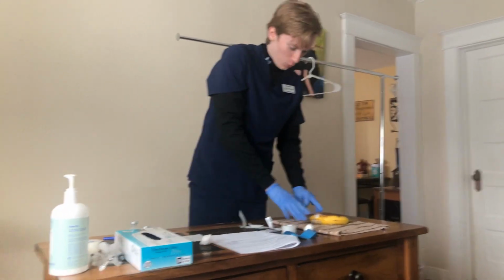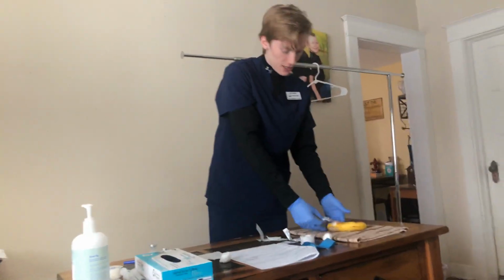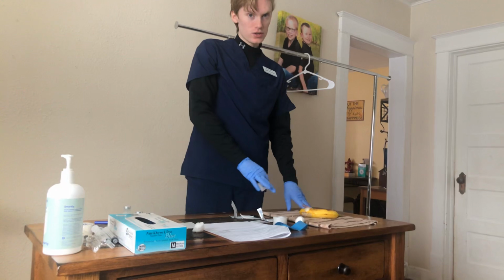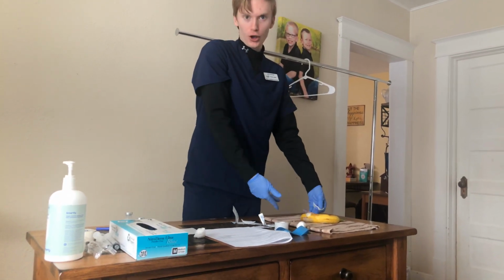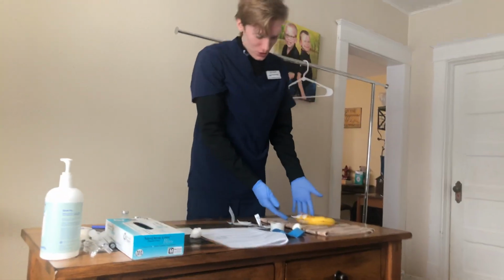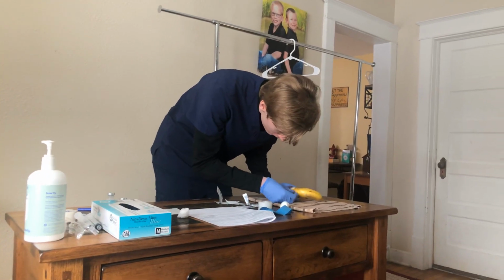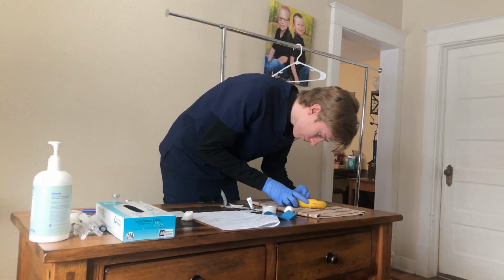I would have placed a bigger gauze pad underneath this, so once I take it out and we have possibly blood coming out, it's not going to get all over the patient, it's not going to get over me, it's just going to get soaked up in a way bigger gauze pad that I do not have. But we're going to place that right there underneath the patient, and then we are going to take off everything except for the cath.